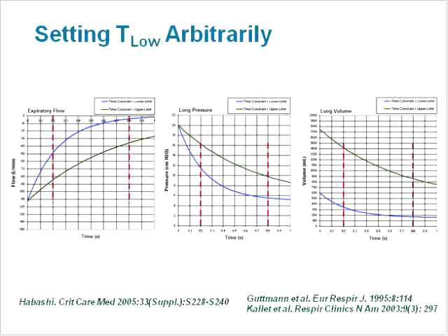If the patient had a long time constant, for example 0.7 seconds, an auto-PEEP of about 10 centimeters would result, the green line in the middle figure. This is about equivalent to the average value of set PEEP in the low tidal volume ARDS-NET study and is therefore probably appropriate. However, if the patient had a short time constant, say 0.24 seconds, the auto-PEEP would only be 6 centimeters or less, the blue line in the middle figure, clearly not sufficient to avoid either oxygenation problems or possibly atelectrauma.